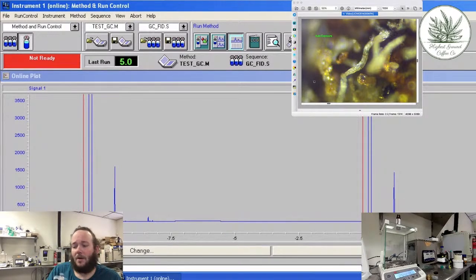So doing that dilution, I needed to use that pipette instead of this pipette. It's just too inaccurate for that small of an amount. And because of what we're doing, errors compound and they travel through. So an error at measurement in one place goes all the way up, and we don't want that.